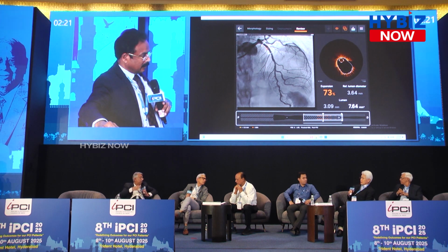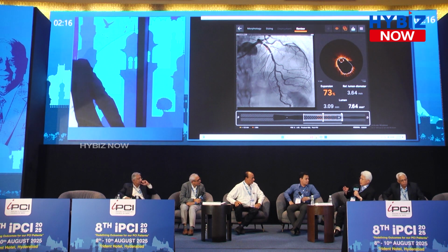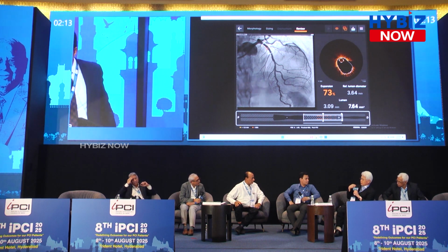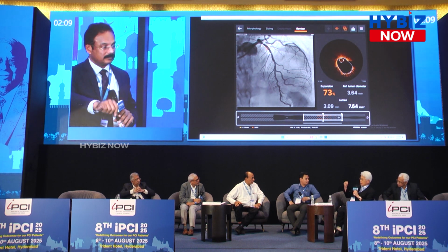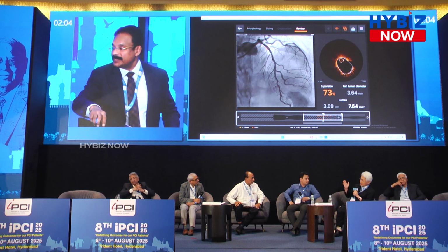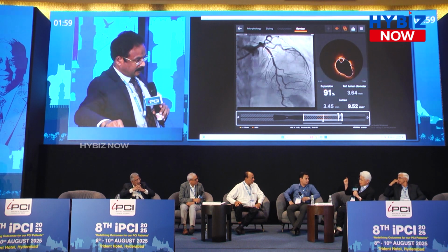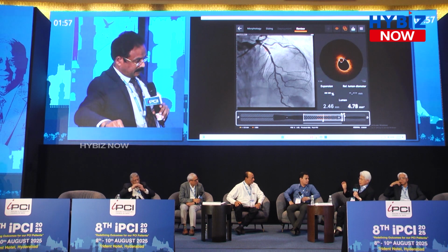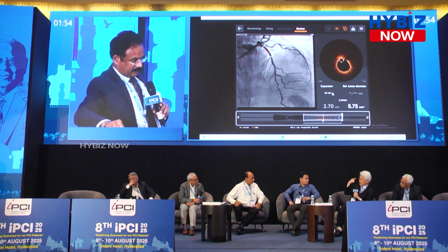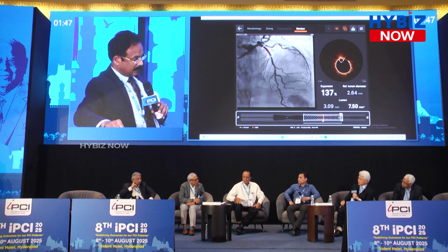Dr. Akasaka, what's your viewpoint on that? Yes, generally speaking, 90% is the ideal expansion. But we have to think about the plaque eccentricity at the same time. Because if you dilate with a bigger balloon, the vessel is dilated on the normal side. Therefore, if there is very thick calcium and eccentric calcium, we have to think about the final result. At that time, we have to accept 80%. That is clinical practice.